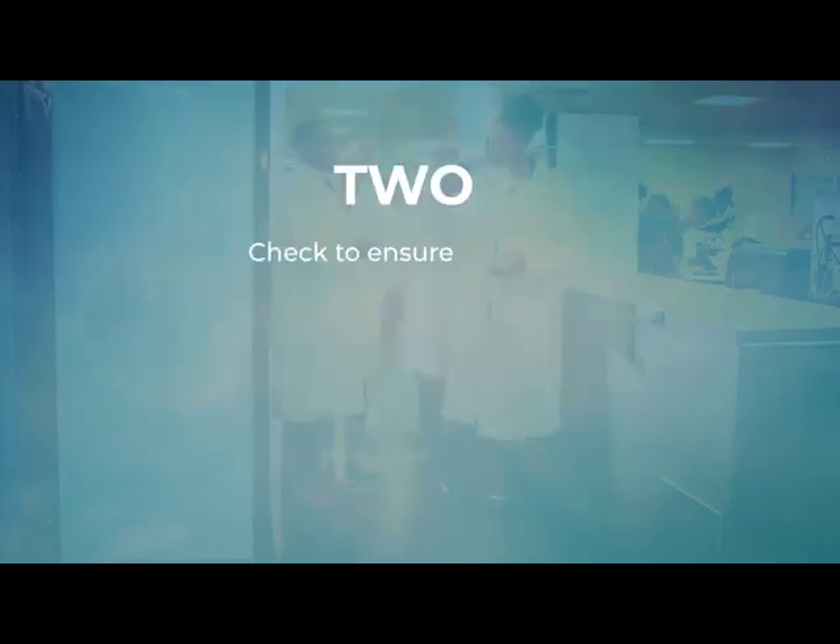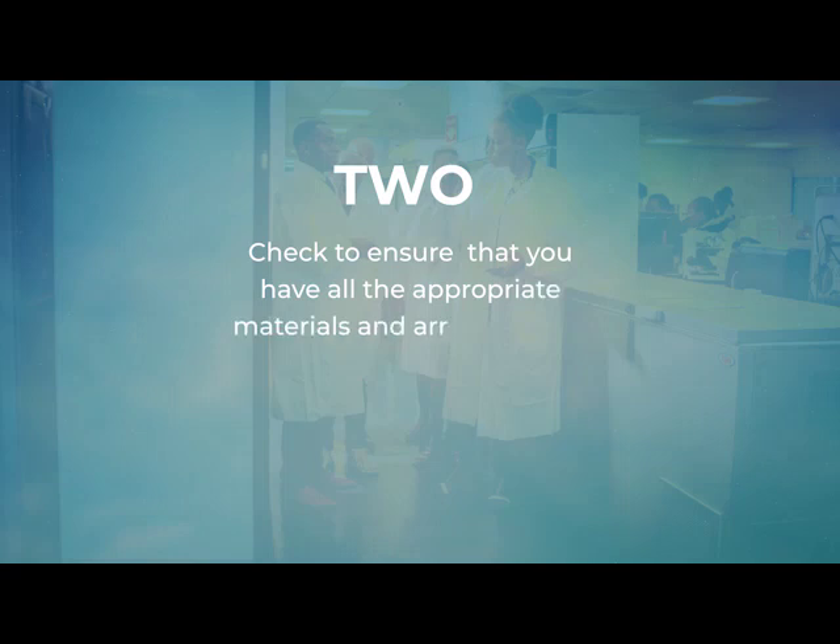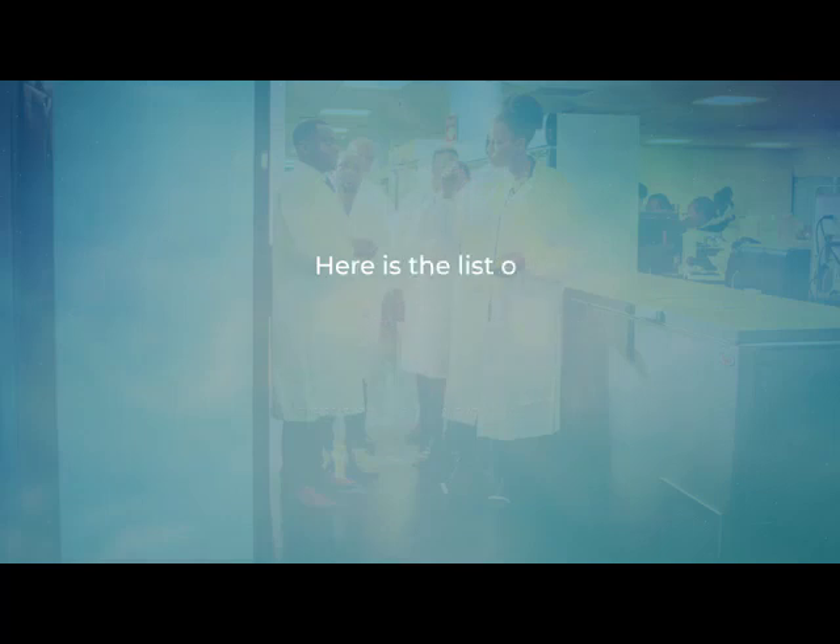Two, check to ensure that you have all the appropriate materials and arrange them prior to starting the sample collection process. Here is a list of the materials needed.